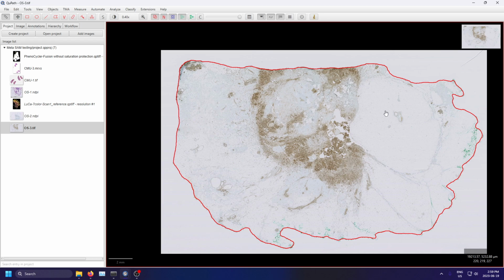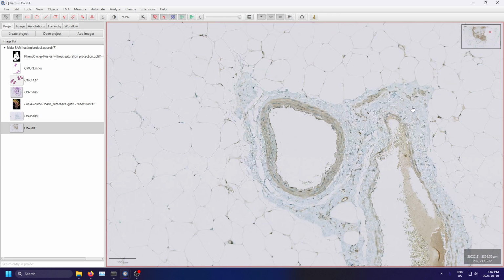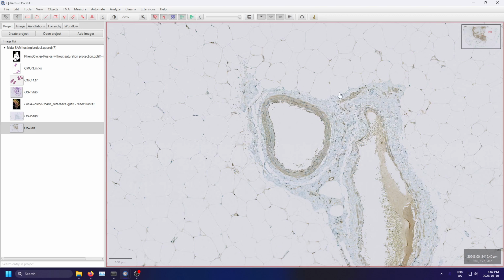And as a result, you have to rely on some domain expert, some human being who knows what those structures are and knows how to label them. If anything, this will be a tool to help speed up the labeling process such that an annotator will not have to spend a lot of time going in and manually contouring a blood vessel. Even though this might be saving a few seconds at most.